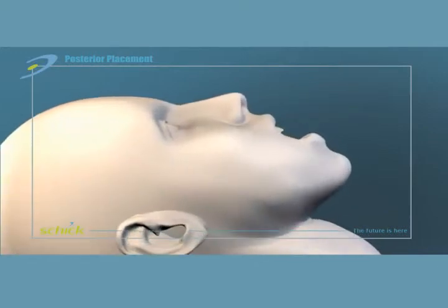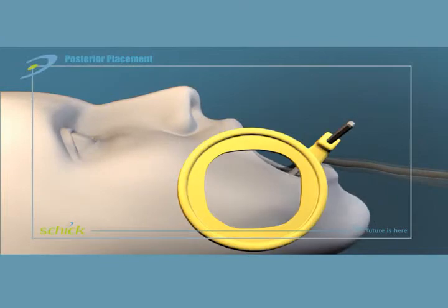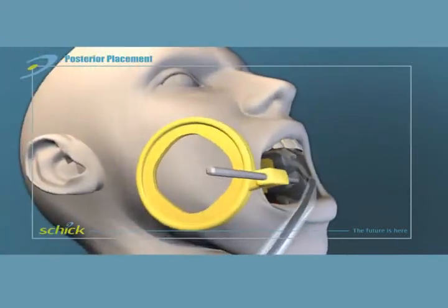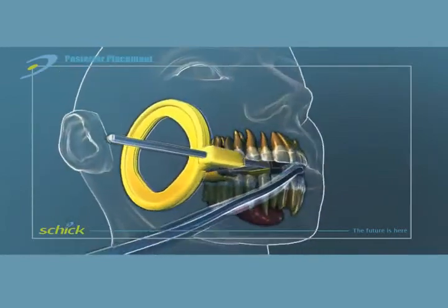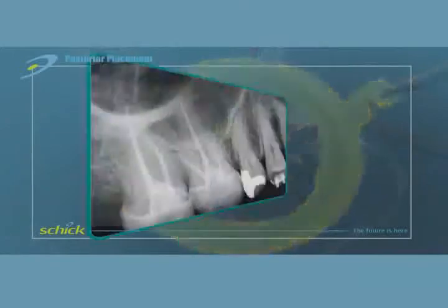Angle the sensor aiming device upward toward the midline of the palate. Place the bite block directly under the teeth to be captured. For a maxillary molar image, center the bite block on the second molar. Position the sensor along the midline of the palate.